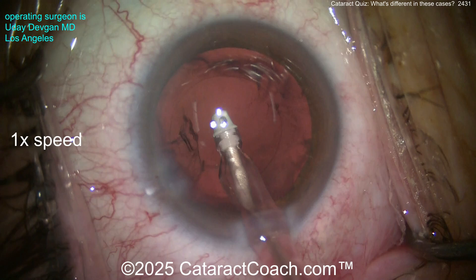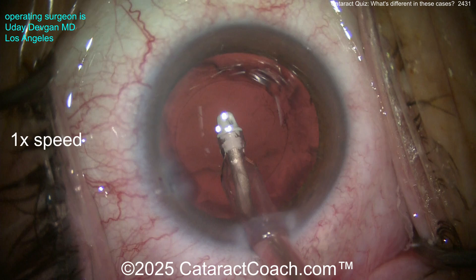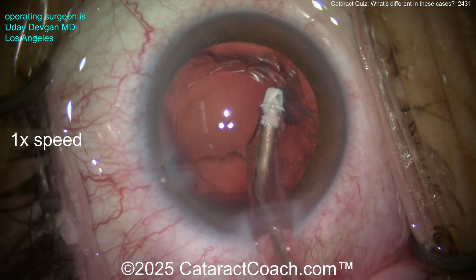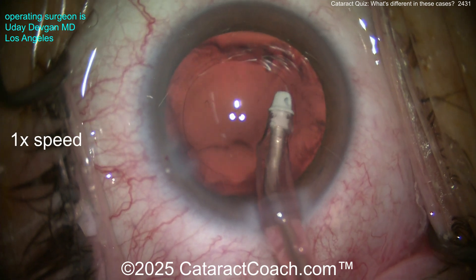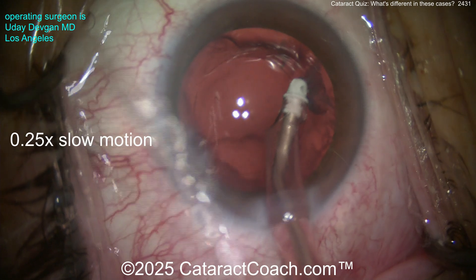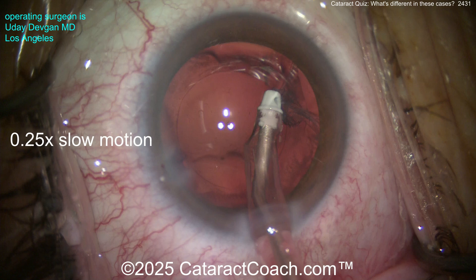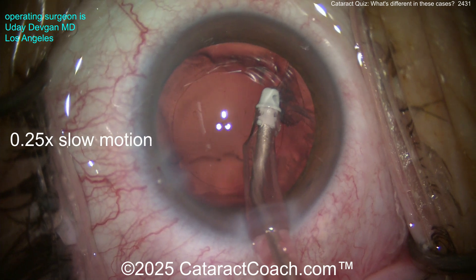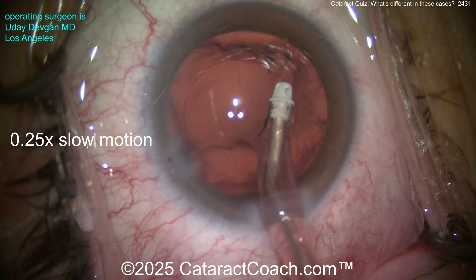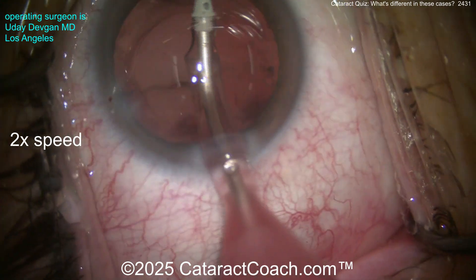Taking out a little bit more cortex — looking pretty clean. Did you notice what happened? Watch carefully — whoa, what's that? That was the capsular bag equator. Let me show in slow motion. See that real clear red reflex back there? You're seeing all the way through to the vitreous cavity. That was the lens capsular bag equator — some focal zonulopathy in that little quadrant.